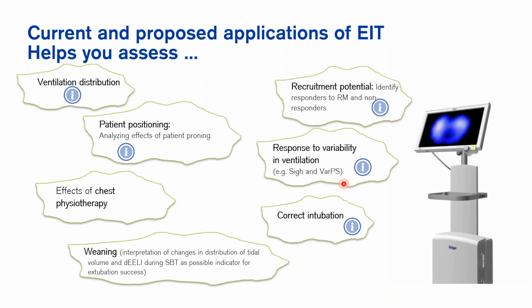If you practice proning in your unit, you can use PulmoVista even during proning. You can use PulmoVista to optimize your settings, so in general, to look if you are reaching the right areas of the lung. You can also check the effects of chest physiotherapy or even weaning.